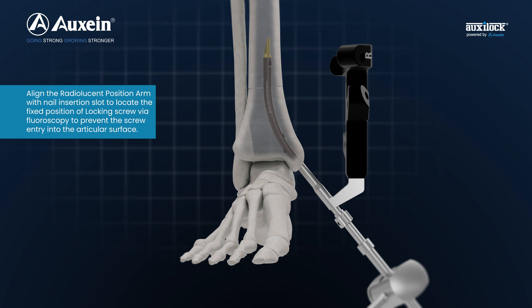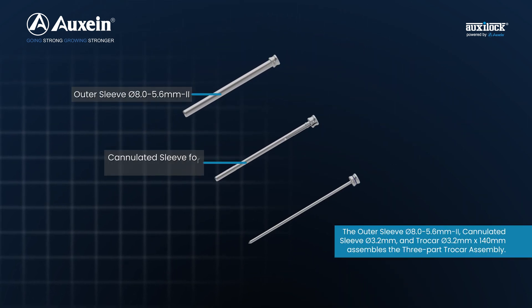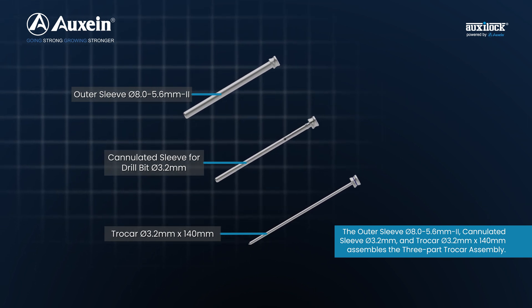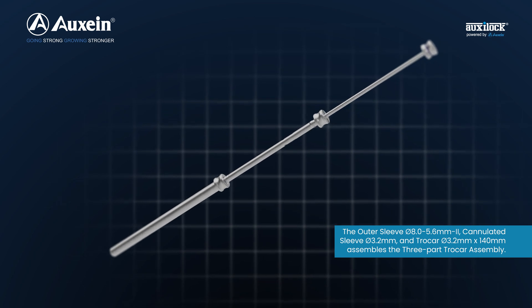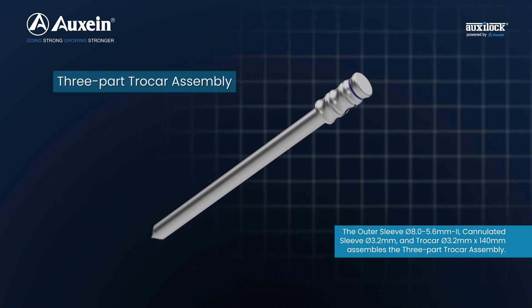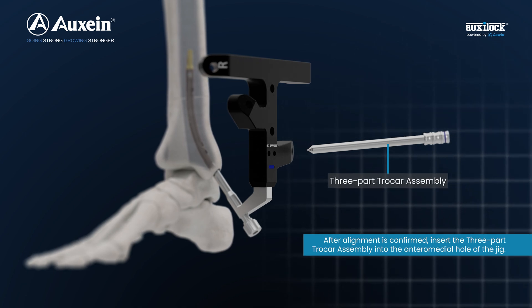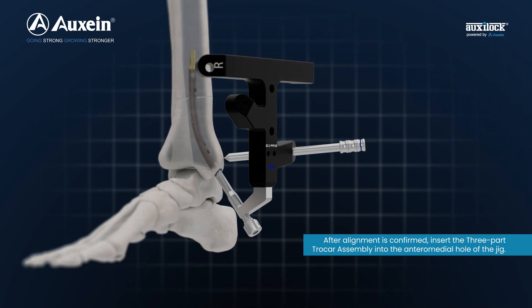Prevent screw entry into the articular surface. The outer sleeve diameter 8.0 to 5.6 mm, cannulated sleeve diameter 3.2 mm, and trocar diameter 3.2 mm x 140 mm assemble the three-part trocar assembly. After alignment is confirmed, insert the three-part trocar assembly into the anteromedial hole of the jig.